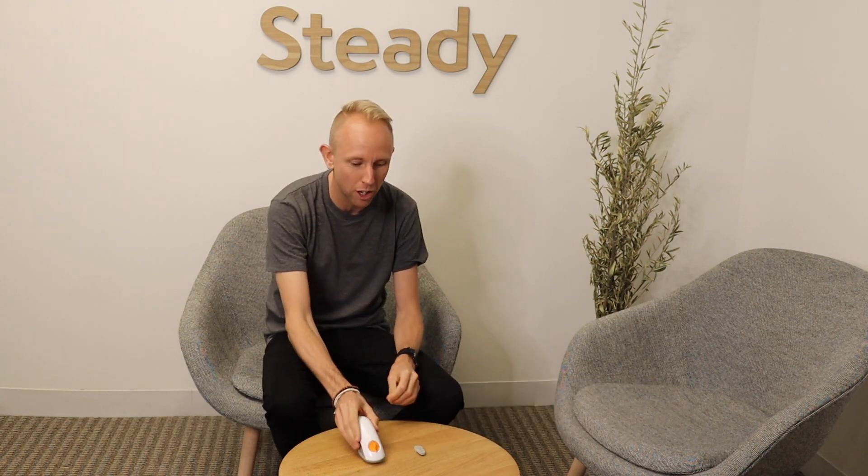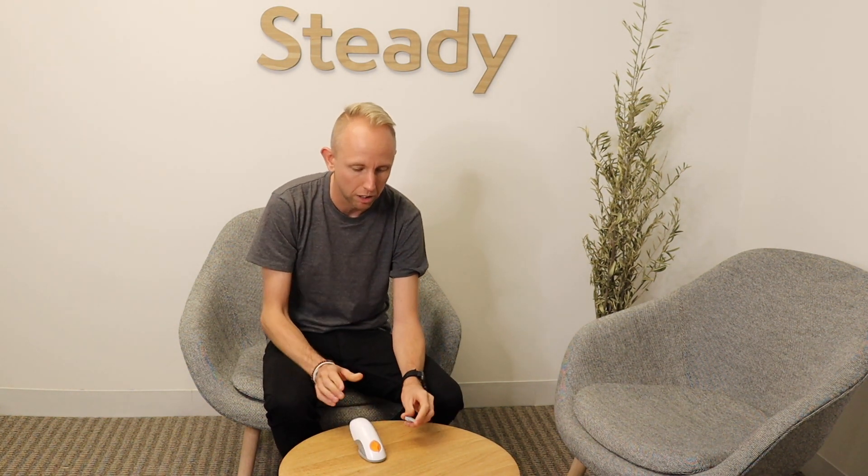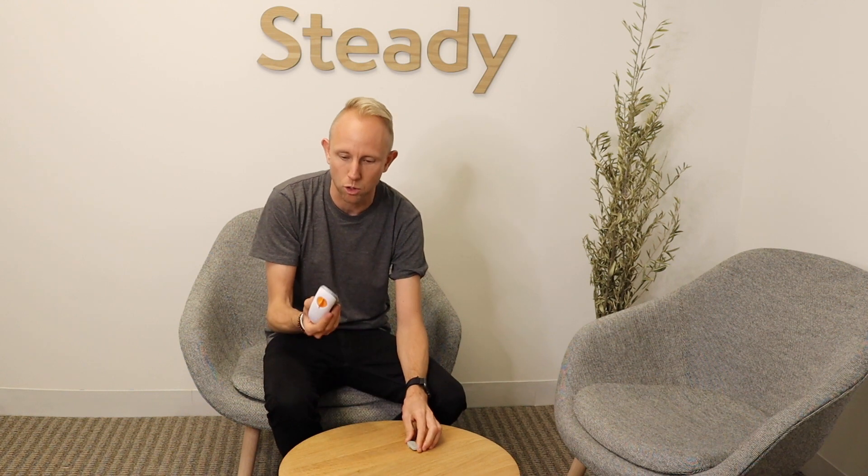My name is Henrik, and I'm the founder of Steady Health. Today I'm going to show you how to insert a new Dexcom G6 sensor. The G6 consists of two separate parts: a transmitter that is good for about three months and you reuse between sensors, and the actual sensor that goes into your arm, which you can wear for about ten days.